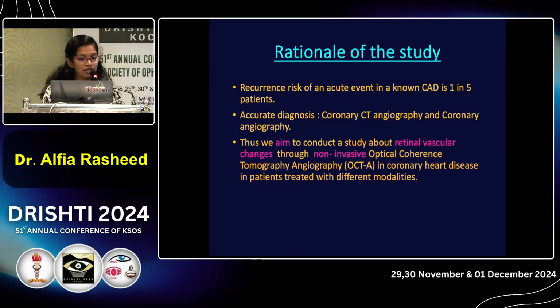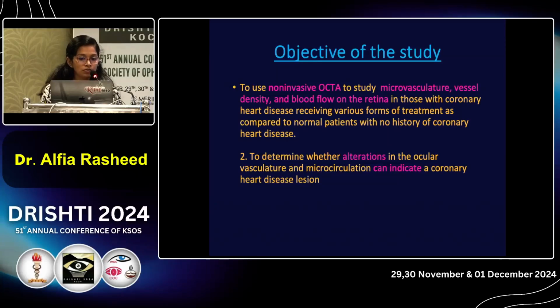But we can't always prefer this in a mildly symptomatic or follow-up patient. Thus we aim to conduct a study on retinal vascular changes through non-invasive OCTA in CAD patients who are treated in different modalities. The objective of my study is to use non-invasive OCTA to study the microvasculature, vessel density and blood flow on the retina in those with CAD and those without CAD, and to determine whether alteration in the ocular vasculature and microcirculation can indicate a coronary heart disease lesion.